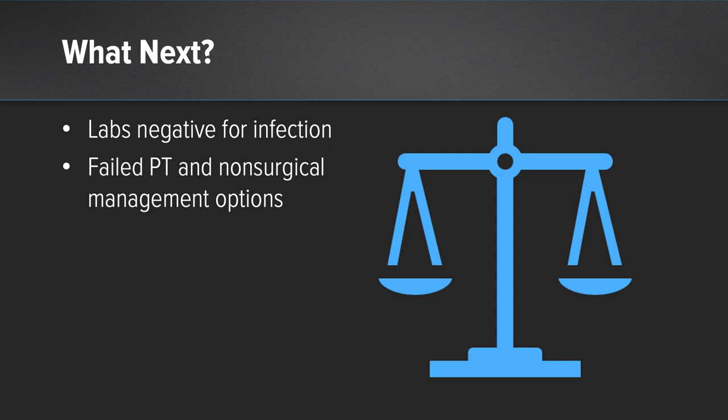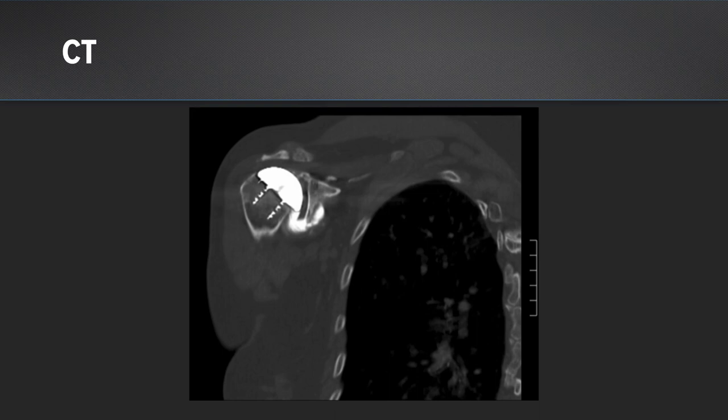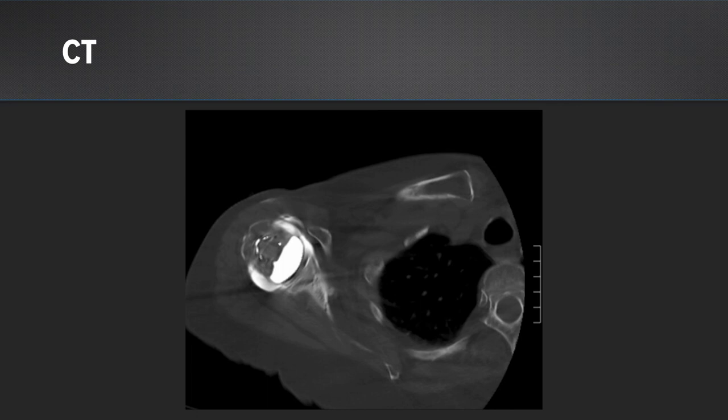Here's her CT scan. We can see no extravasation of the fluid superiorly on this coronal image. We can see great integration of bone within the cage screw and around it, and no real concerns for glenoid-sided loosening. On her axial images, however, there was some extravasation — not really a lot of tissue that could be seen anteriorly — raising concerns for a subscapularis failure.